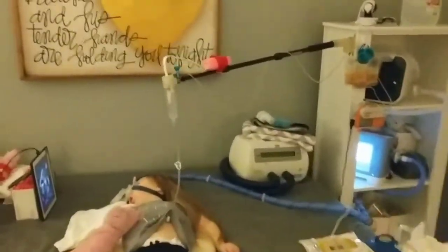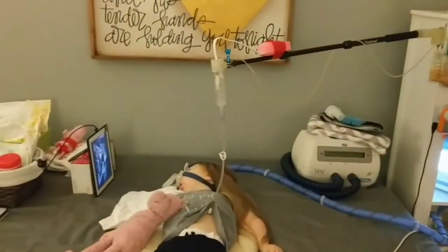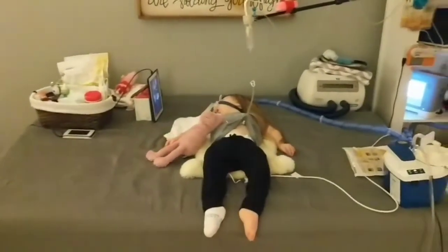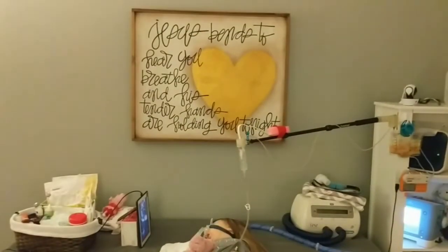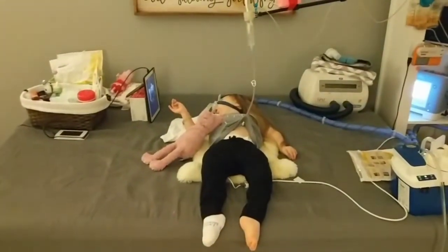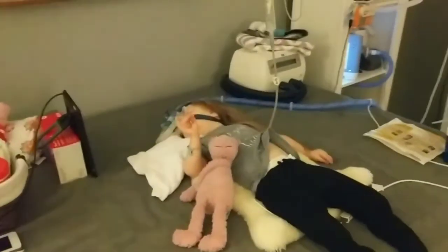Plus we don't have that big ugly thing anymore. If I want, I can close it all the way — pretty far down — swing it out of the way, and she's got full use of the bed. Much nicer, especially now that we don't have to worry about banging up Grace's awesome piece of art. We can move this growing girl all around the bed rather than being restricted to that one spot in the middle.